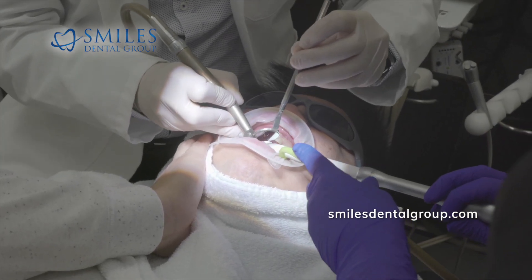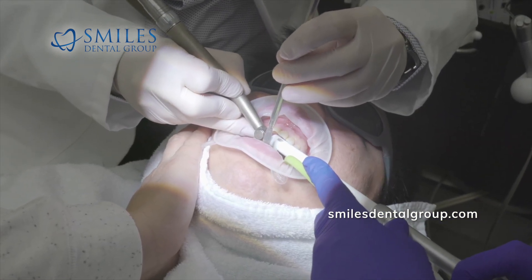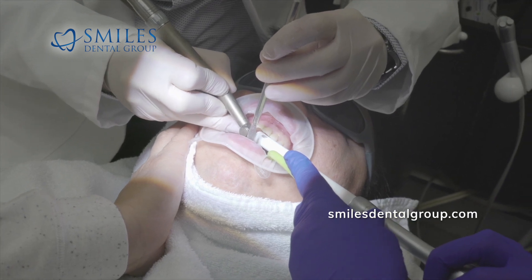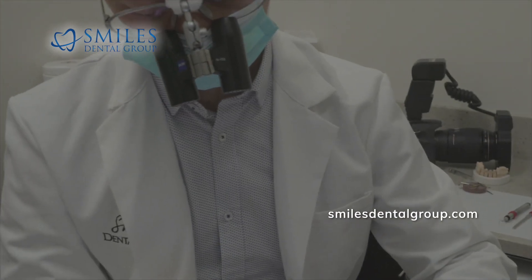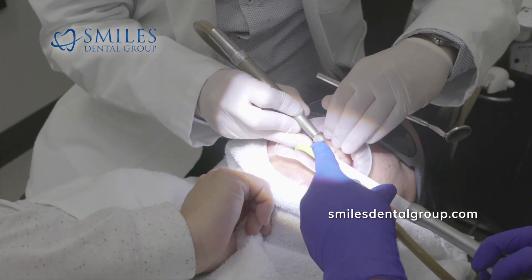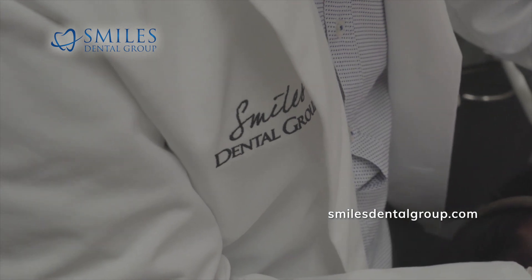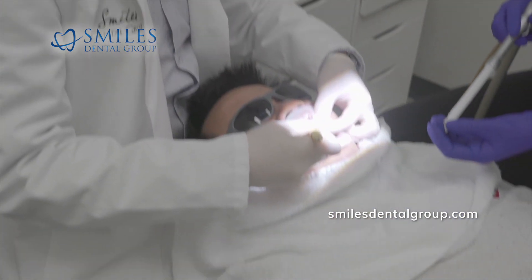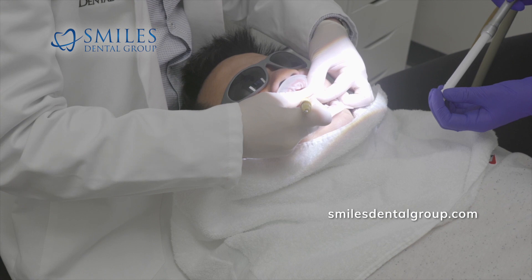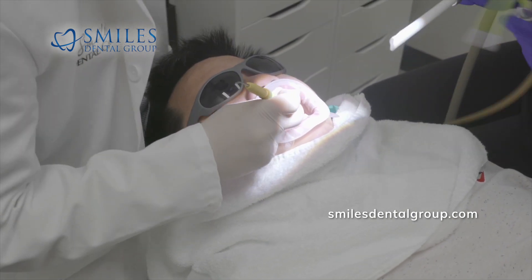I'm using a very fine mosquito diamond burr to remove the temporary restorations. The temporary restorations had to last six weeks for Michael. I did spot bond them, so they are more difficult to remove than normal temporary restorations. They're also splinted to each other. We did the anterior four front teeth.